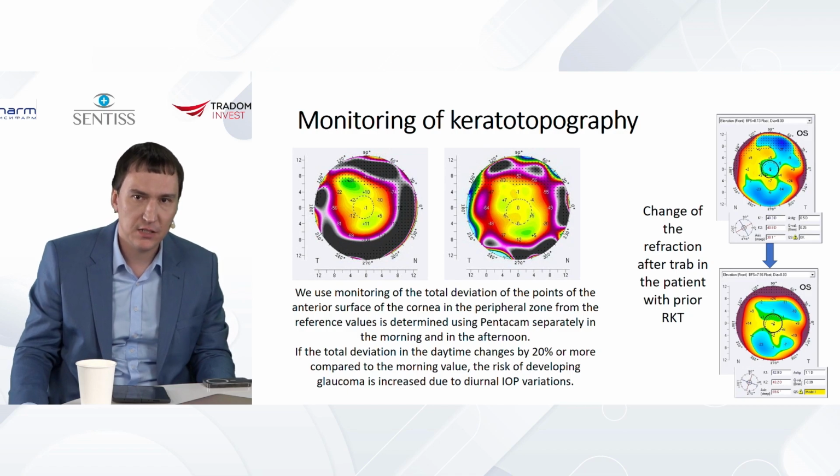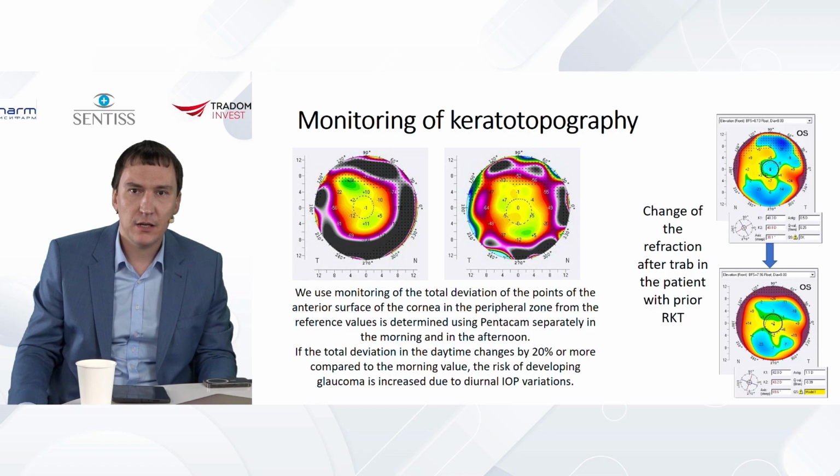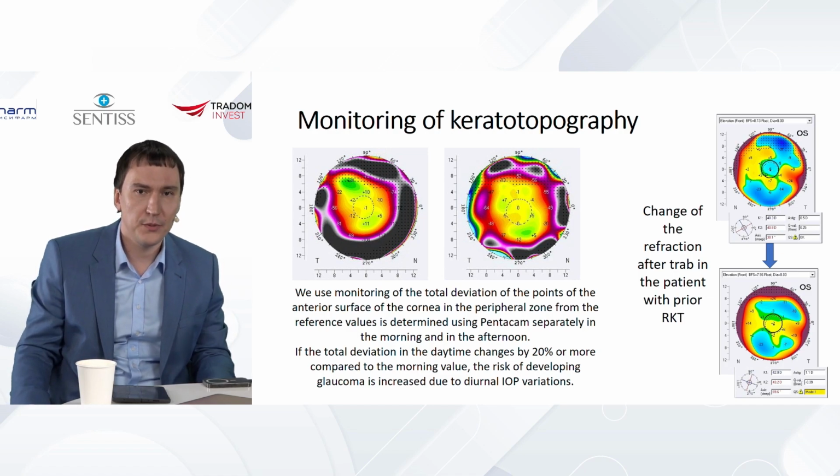if we talk about the convenience of image visualization and analysis using AI, so keratotopography, that means signature, the pattern, so all that is related with the changes of IOP. This is a very famous statement, but normally we don't pay enough attention to the fact that the dynamic analysis of keratotopography could be one of the ways to control IOP.